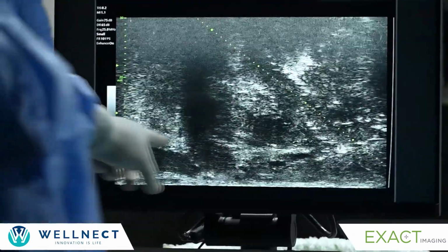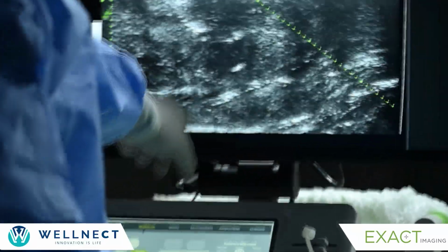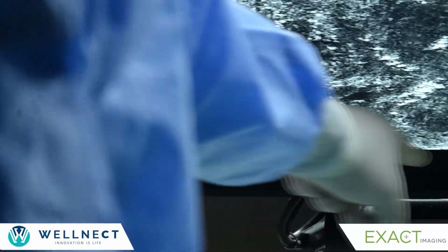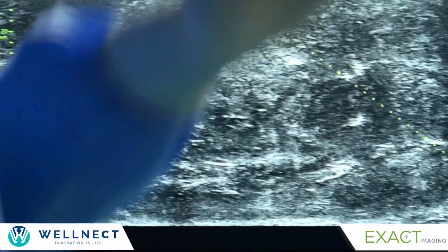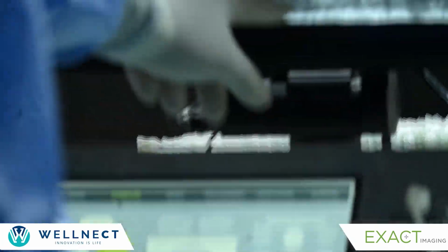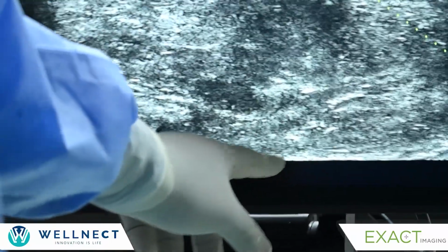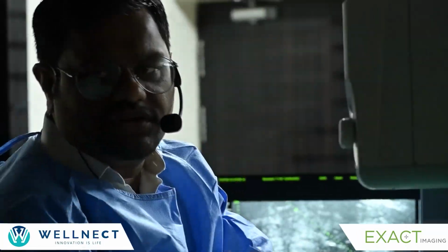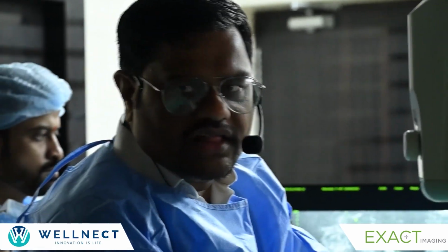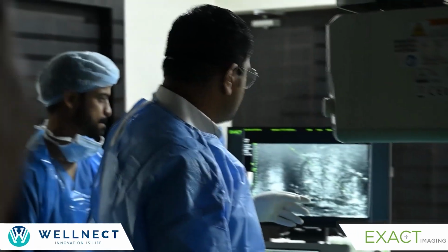Now there are two things that you have to see. This is the prostate, and if you see, then this would be rectum, this is the prostate. Now this is a white line that you see. Can you see this white line over here? Yes, sir. Now what is this? This is the fat present between the prostate and the rectum. Now, if there is an extra prostatic extension and if there is involvement of the rectum, you would see this breach of the white line and you have a lesion over here. Then that means probably the fat plane between your rectum and the prostate is lost, and then you should be taking extra steps either to operate or to give some neoadjuvant hormone therapy and think in those ways.